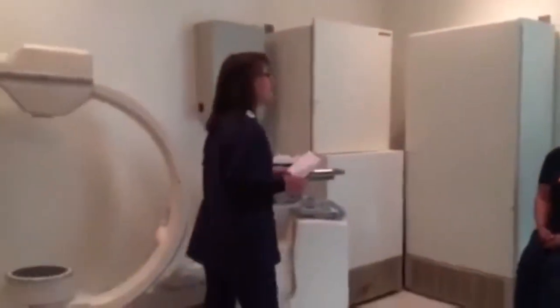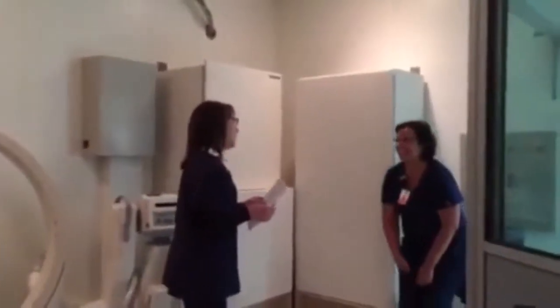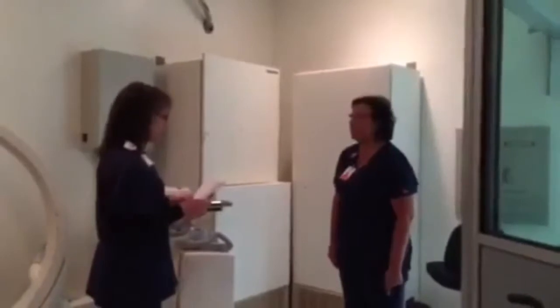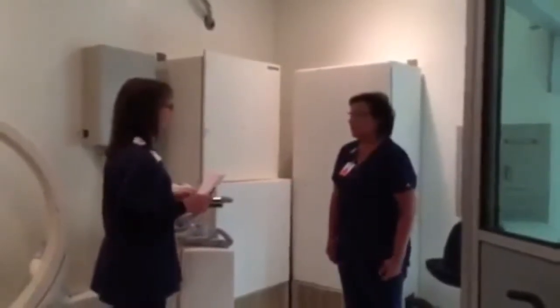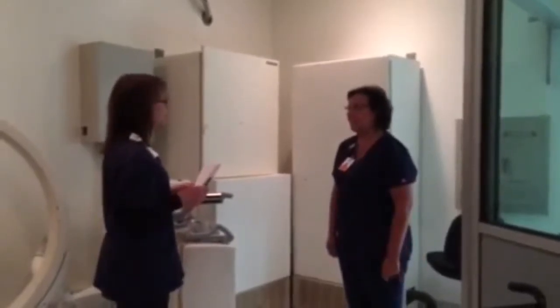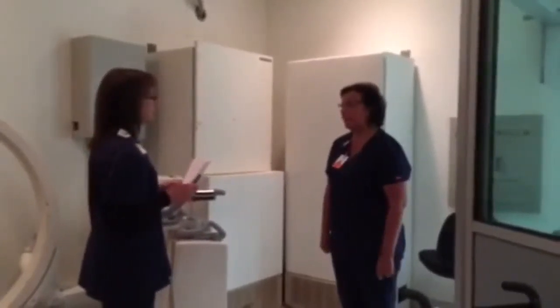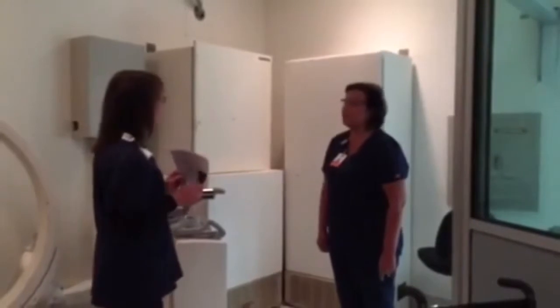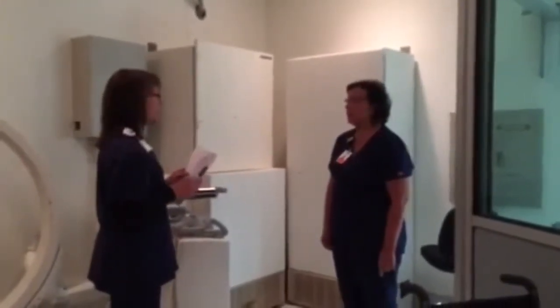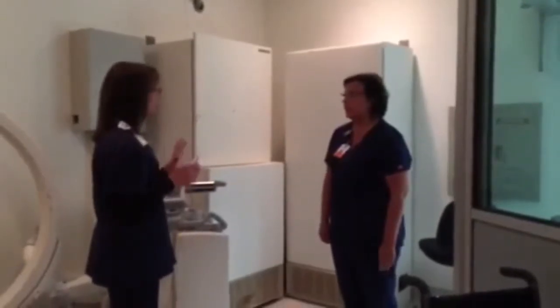Okay, Mrs. DeWitt? Yes. Hi, Mrs. DeWitt. My name is Lisa. I'm from the radiology department. Yes, I'm here to do some x-rays. Can you tell me your first and last name, please? Elena DeWitt. Okay, and how about your date of birth? 9/27/72. Okay. Is there any chance that you're pregnant today? No. Okay. So the doctor's orders say that we're going to be doing some x-rays of your shoulder. Can you tell me what's happened?